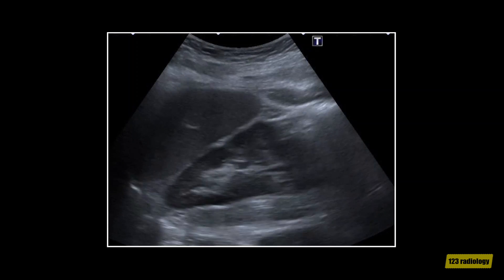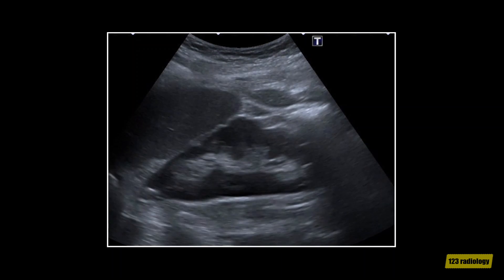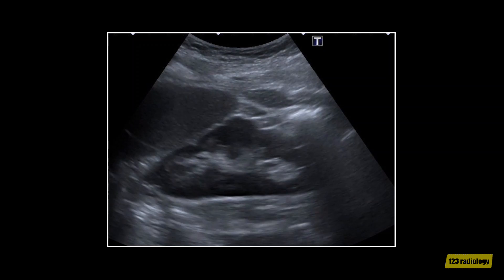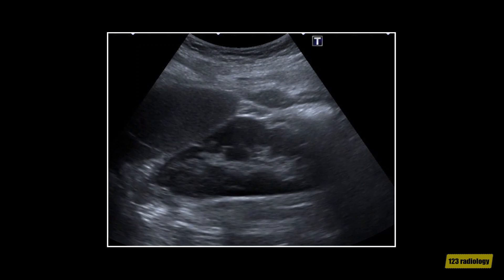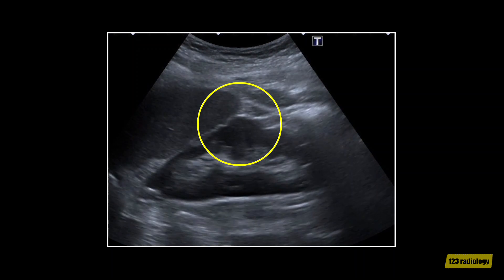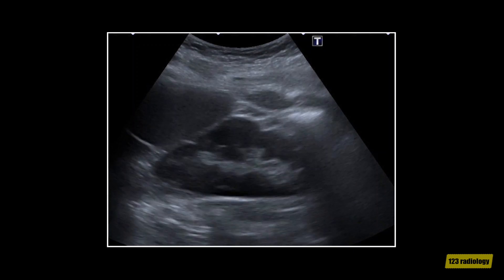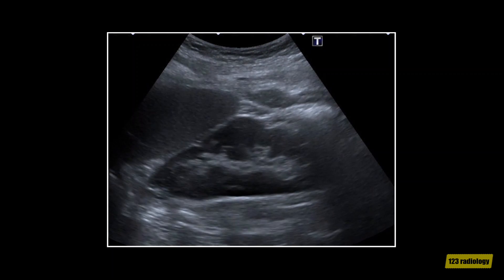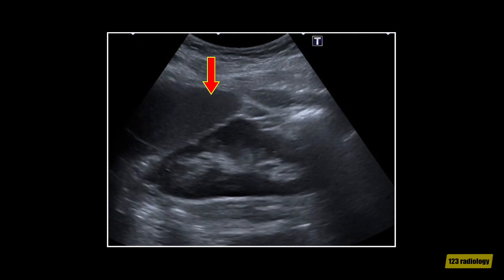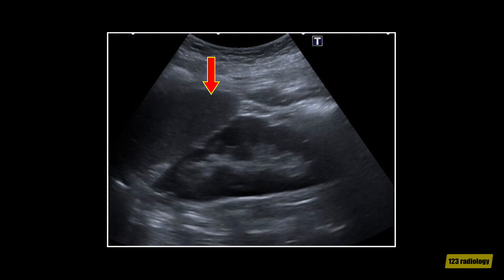This video clip shows a case of dromedary hump. This is a longitudinal view of the left kidney. It shows a focal bulge arising from the lateral border of the left kidney. This bulge shows the same echogenicity as the adjacent normal renal parenchyma, consistent with a dromedary hump. The inferior edge of the spleen is seen superiorly, adjacent to the kidney.